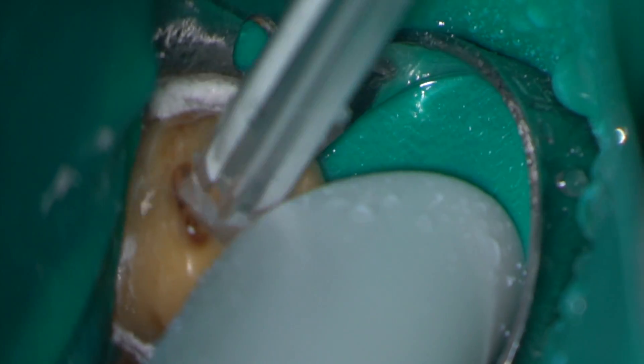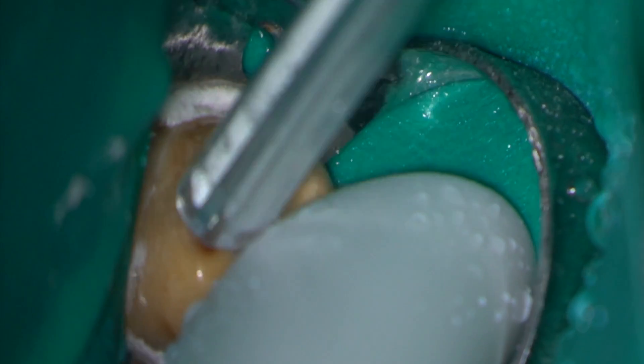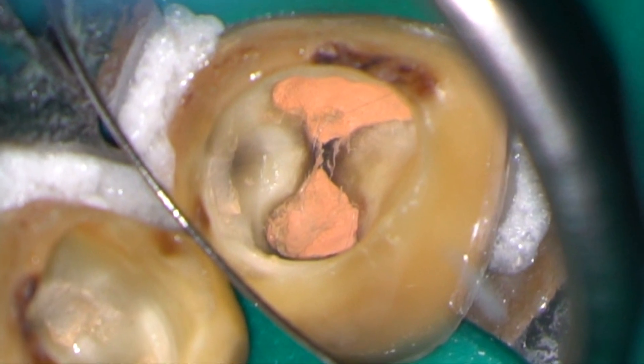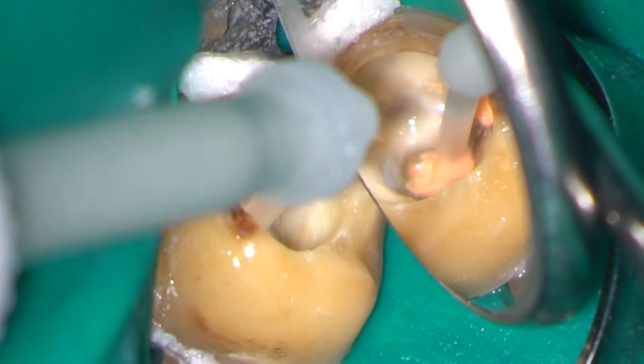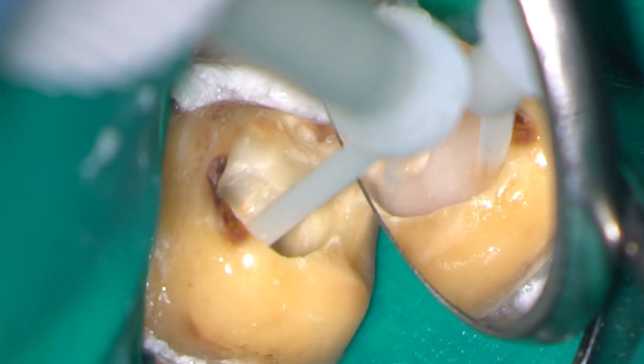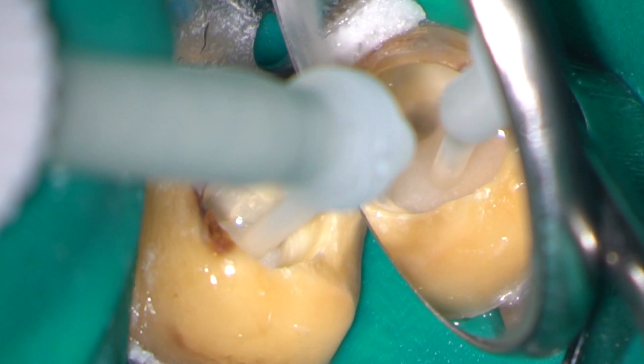Excess sealer can easily be removed with a 3-in-1 tip. The access cavity was simply filled in this case with a dual-cure composite using a full etch and dual-cure bonding agent.